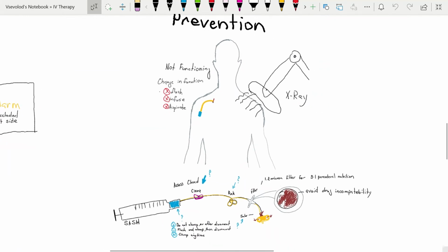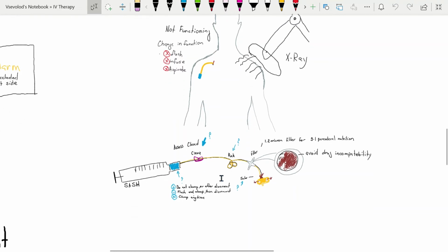would be: ensure and verify proper catheter tip placement in the central vascular access device, superior vena cava, near its junction with the right atrium. Then make sure the catheter and tubing do not have any kinks or closed clamps. Assess the suture sites if they're not too tight. Use saline, administer saline heparin technique when administering medication.